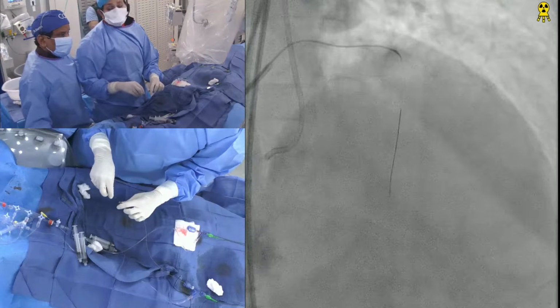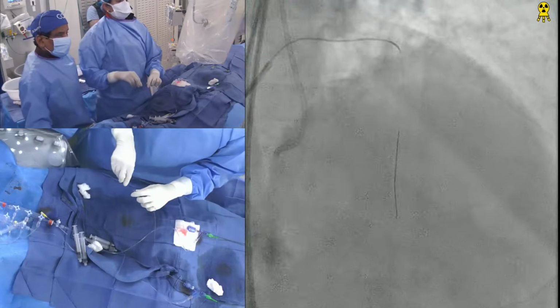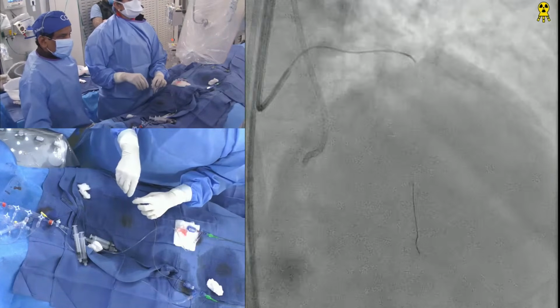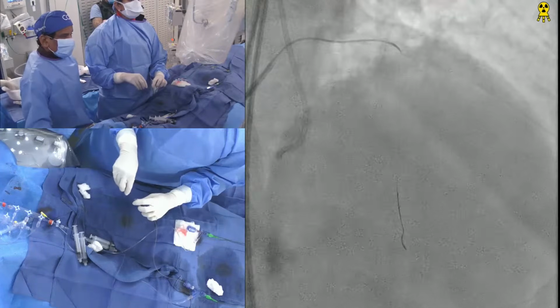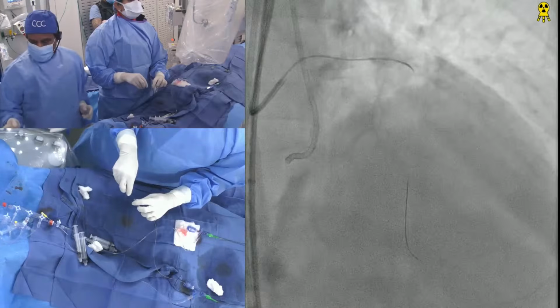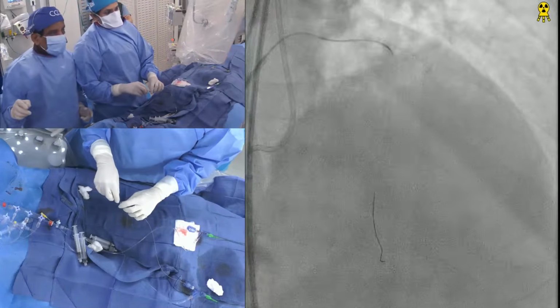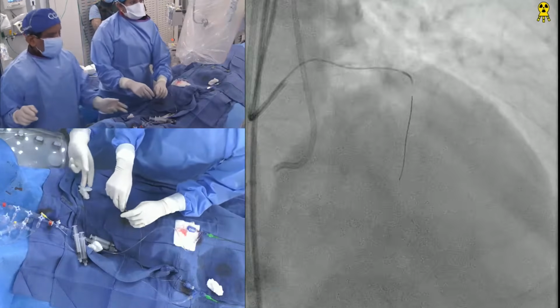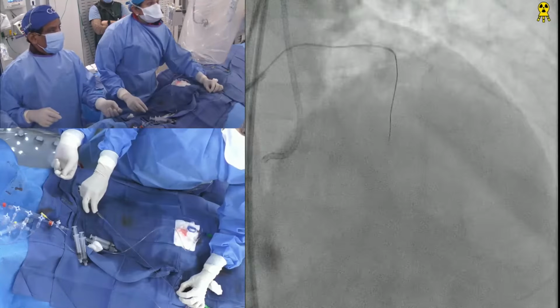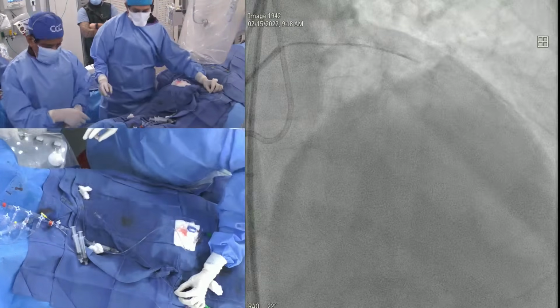Okay, open that black. But you have to go distal for that. I don't want to go there not knowing these wires will not go. See there? They're not making the turn into the RCA direction you need. If they don't go, you destroy it, right? Let's get the black. After this, we're done. That is also the conclusion our viewers seem to have reached. Ready? Then bring back the patient.